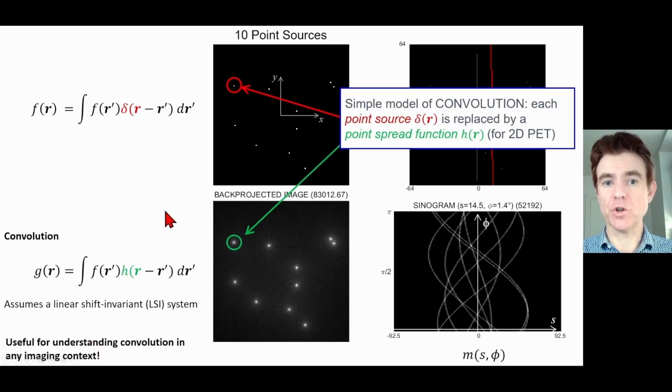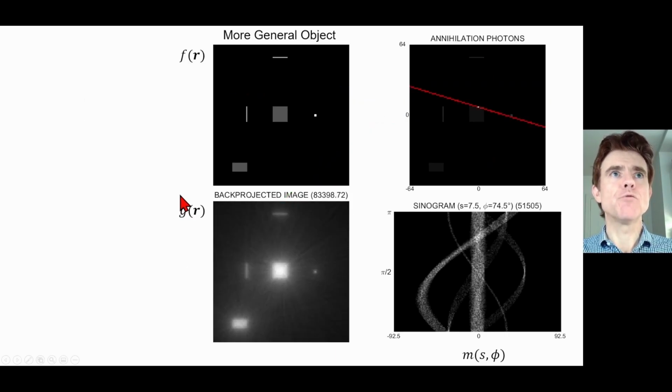And just to point out again that convolution is very important to understand in many fields, and this is a very useful way of getting introduced to the convolution integral. Right, let's get back to our data acquisition case.